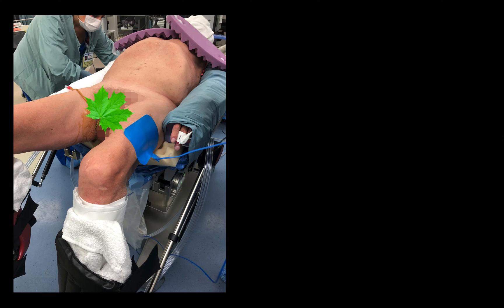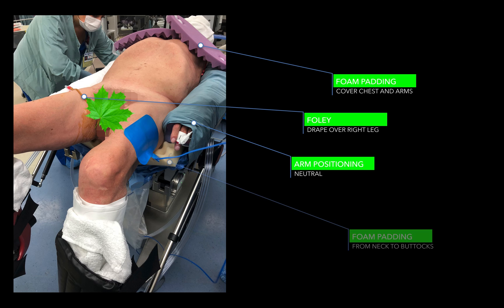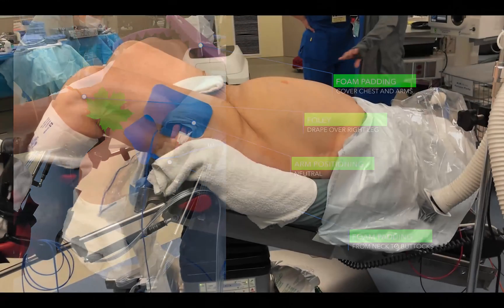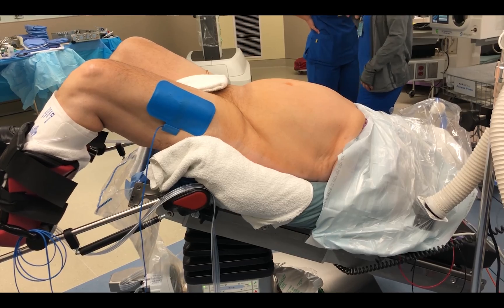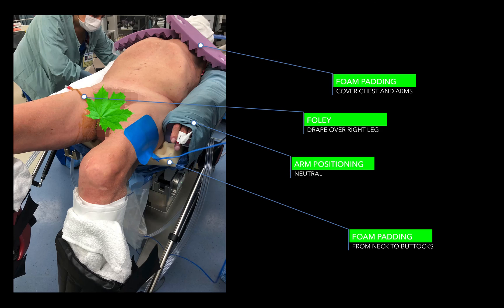I then place foam or a sheet over the chest, basically at the level of the nipples, and tape the patient to the bed snugly but not too tight — I want to be able to easily get a few fingers in between the foam and the chest. The Foley goes over the patient's right leg, and there is adequate padding and securement of the upper extremities with a generous thick foam pad spanning from the neck down to the buttocks. I then test to make sure the patient is safely secured by placing the bed in as much Trendelenburg as it will give me, to check for any slippage.